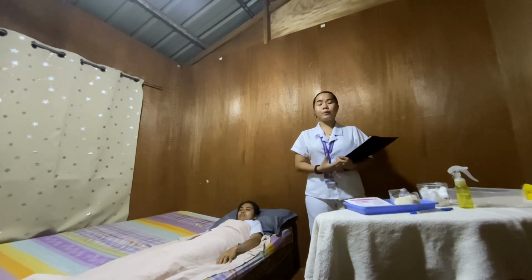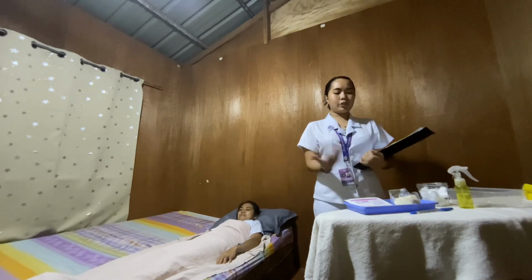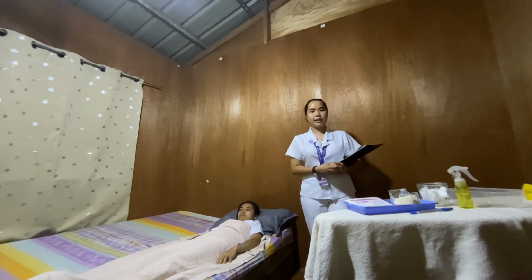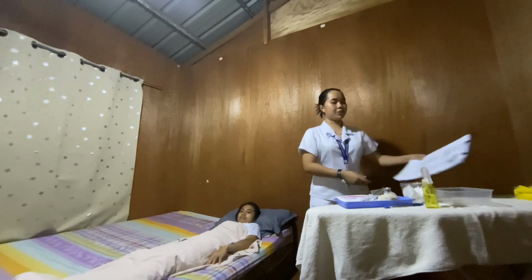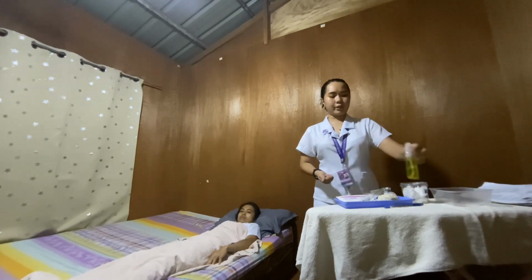It is also important to organize our equipment. As you can see here, I have already prepared all my equipment. This is to conserve time and energy. The next thing to do is to perform hand hygiene. This is to deter the spread of pathogenic microorganisms.